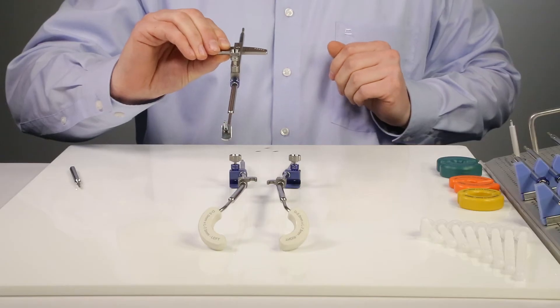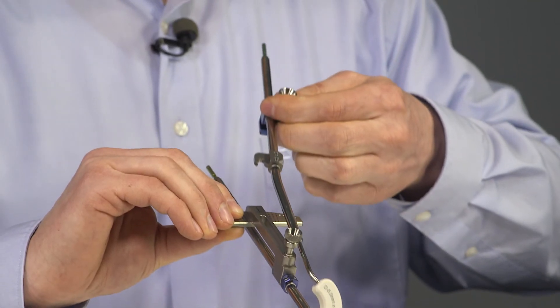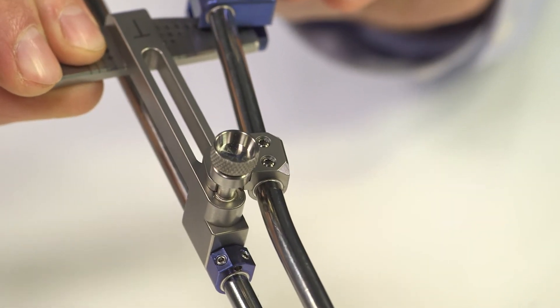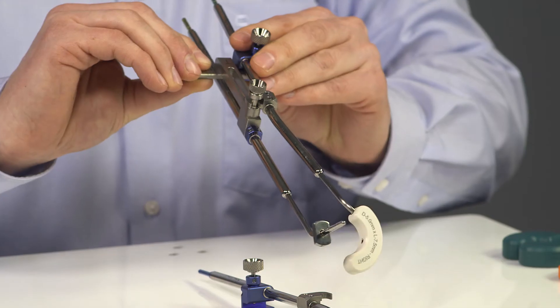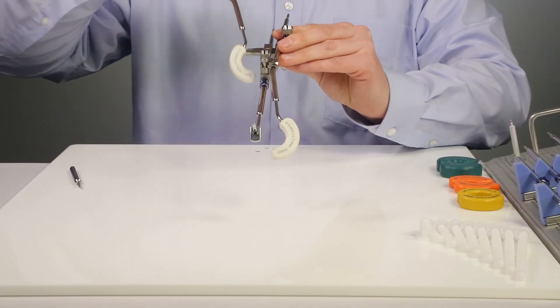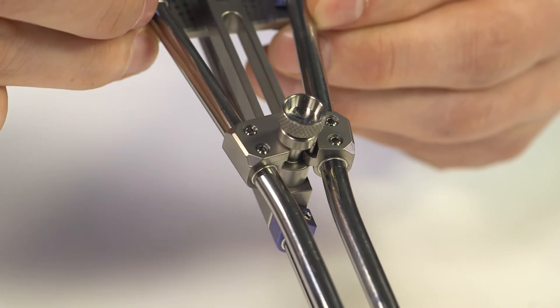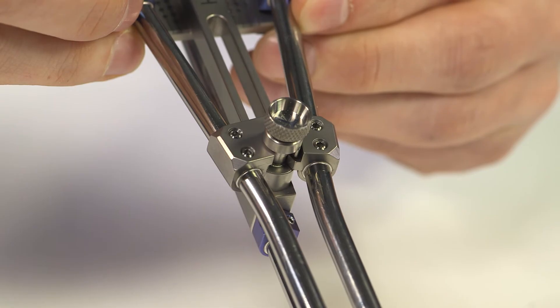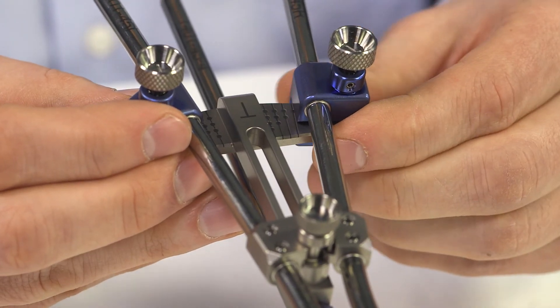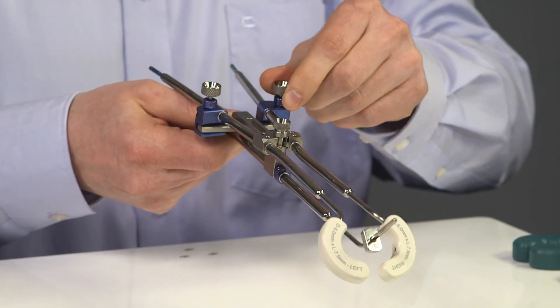Now I select the right split ring, insert it and simply lock it into place. Now the left split ring is inserted and locked into place. Once the desired ring angle is selected, it can be simply fixed with the corresponding screw.